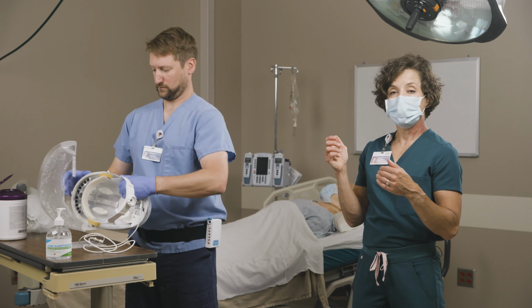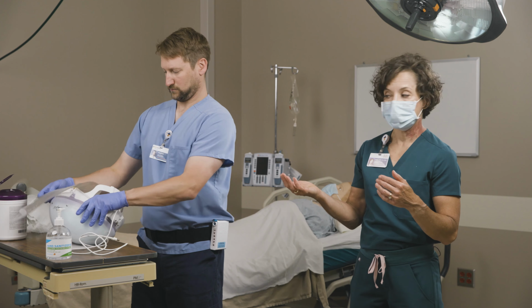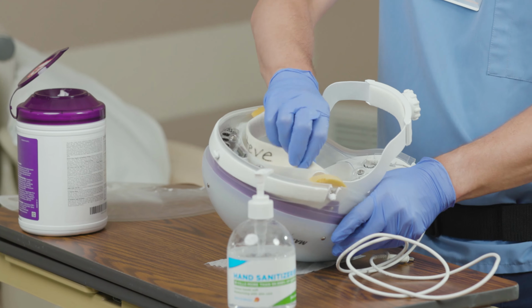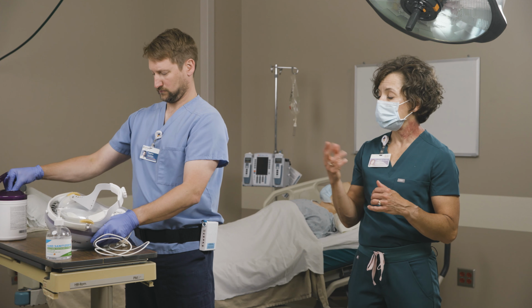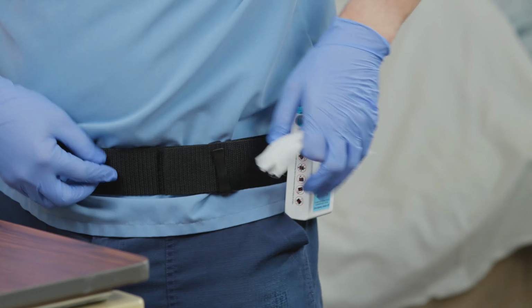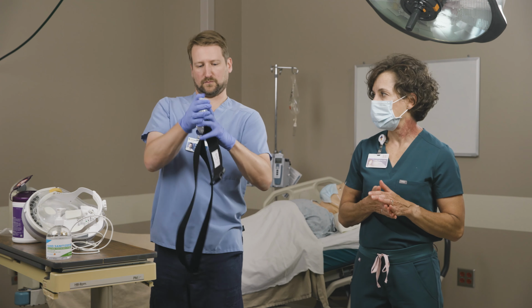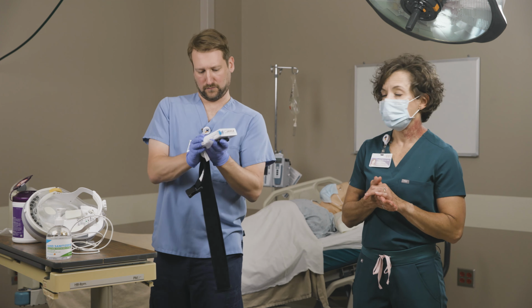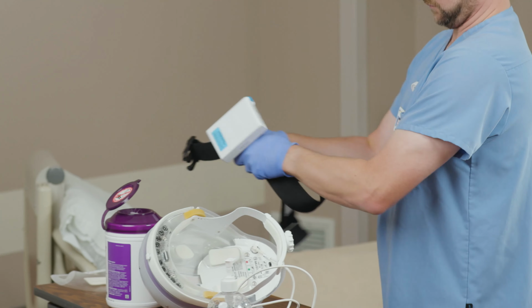And if you're practicing reuse technique of your lens cuff, you would store it in the designated space on your unit. And then he's going to remove the comfort strip and store that where the lens cuff is stored. He's going to put the CAPR back where it goes. Next, he's going to remove his belt and battery and disinfect those with a disinfectant wipe and place them back in the CAPR cart or the designated storage area.